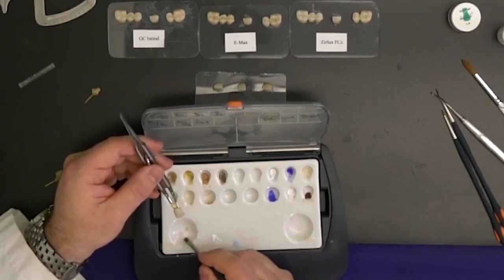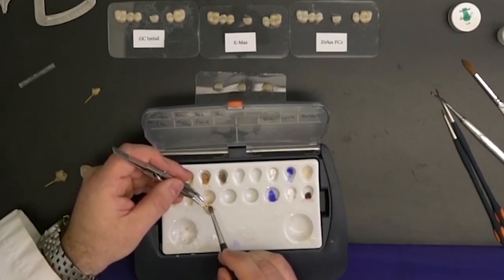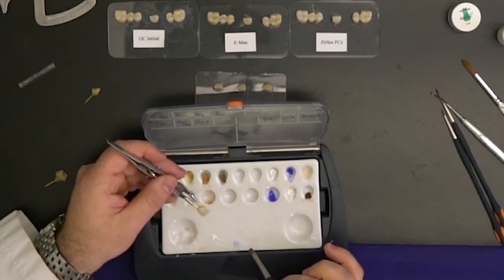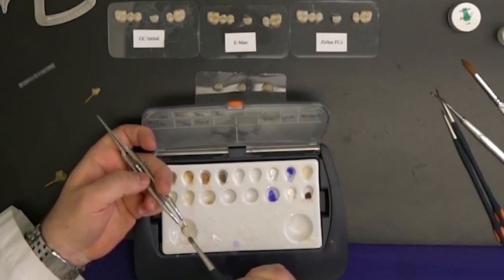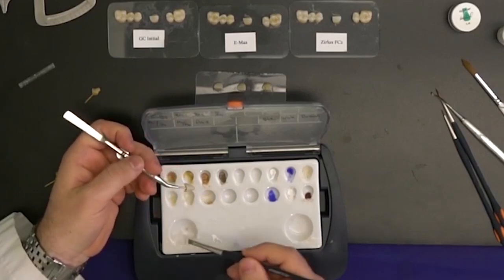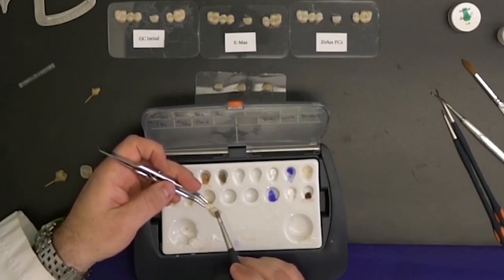What I always do is start with a little bit of the neutral, just dilute it slightly, then sparingly put it on the actual restoration. I always go from mesial to distal — I never go from gingival to incisal because then you can get glaze or stains inside the crown, which is something you absolutely want to avoid. I just lightly lay it on very thinly, where I have an almost-glazed surface already.